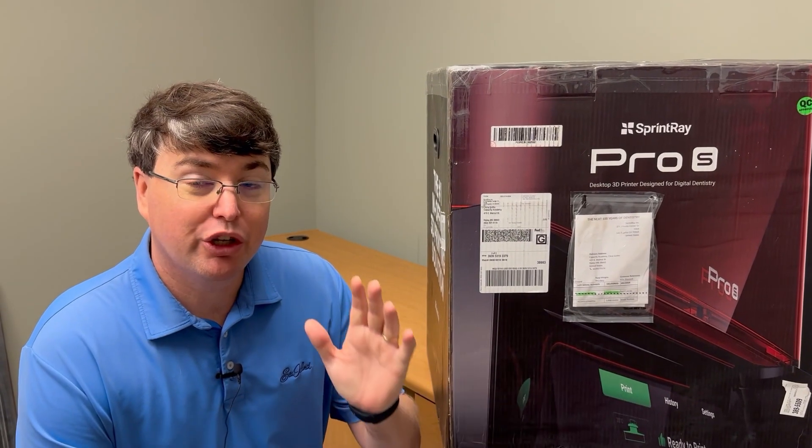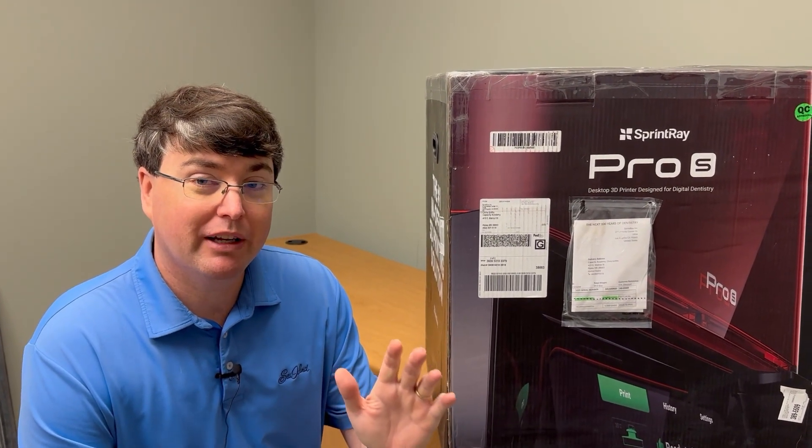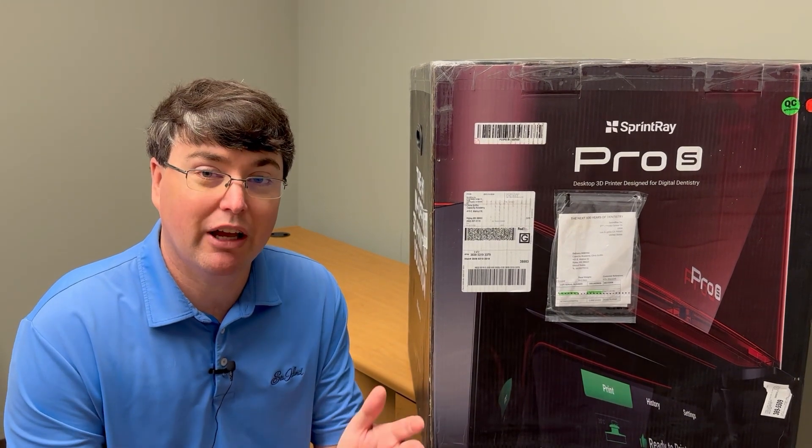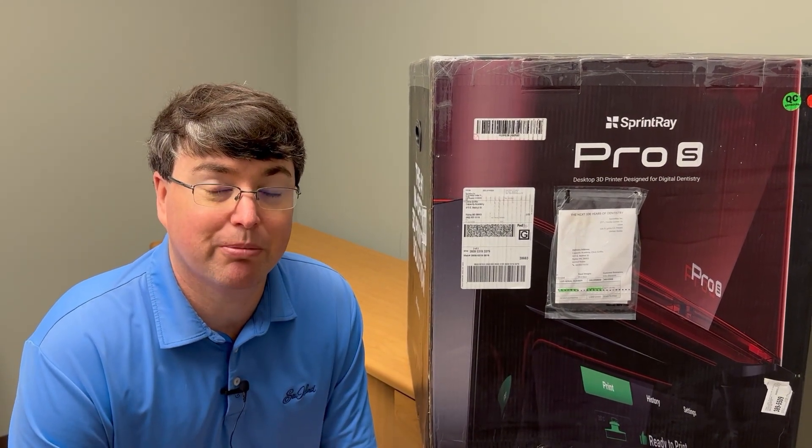How do you unbox your brand new Sprint Ray Pro 95S printer? I'm Dr. Chris Griffin, founder of the 3D Printing Association for Dentists, and this is the video series that helps you get 3D printing started in your practice.